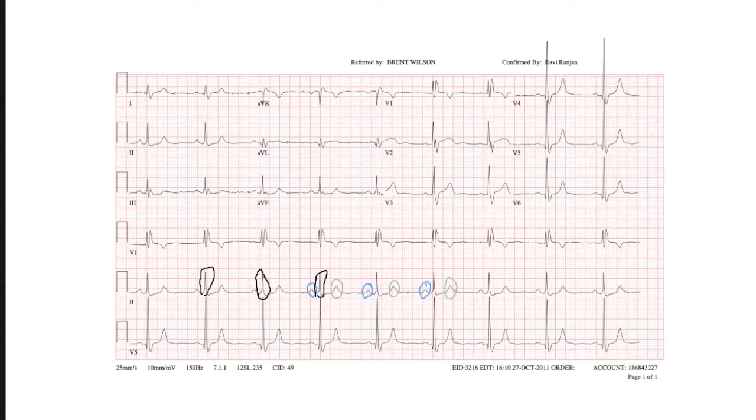Is the QRS the same as the P? Is the big spike a P wave, or is that just all QRS? There's no P wave here, it's messed up. It's the QRS. There are essentially two peaks in the QRS rather than the standard one that we see.